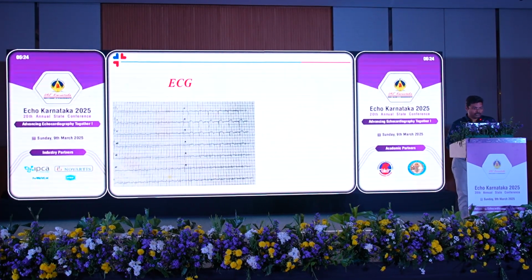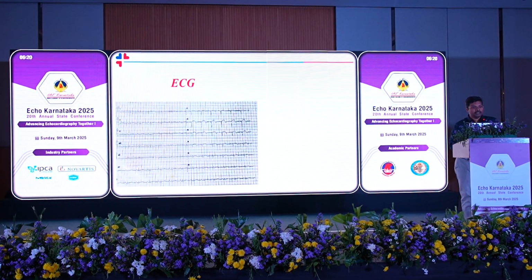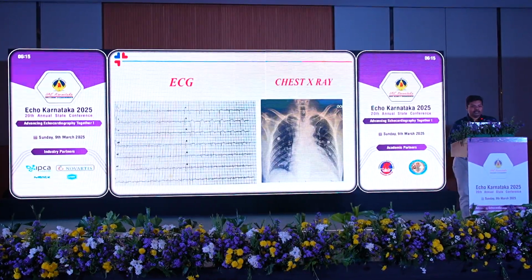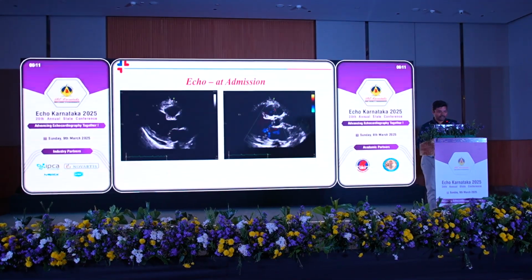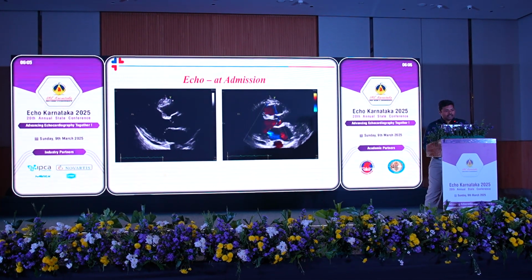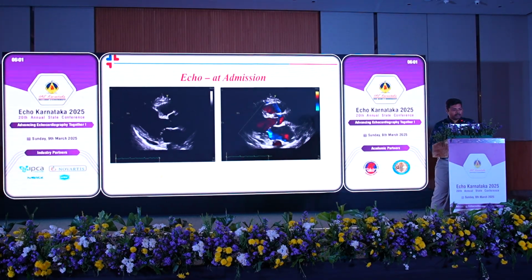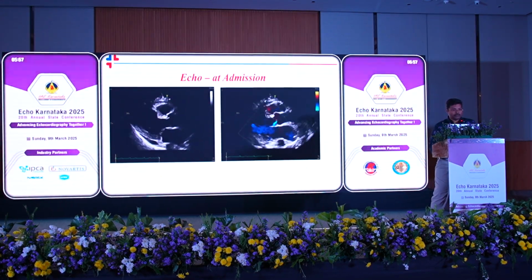The ECG showed evolved anterior MI changes with convex ST segment, ST-T changes in the anterior leads with T inversion. Chest X-ray showed cardiomegaly with prominent aortic knuckle and signs of pulmonary venous hypertension. The echo showed dilated aortic root with mild AR and significant MR with severe hypokinesia of the anteroseptum and mild pericardial effusion towards the LV side and mild collapse of the RVOT.